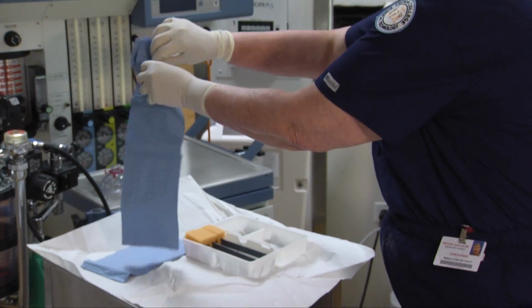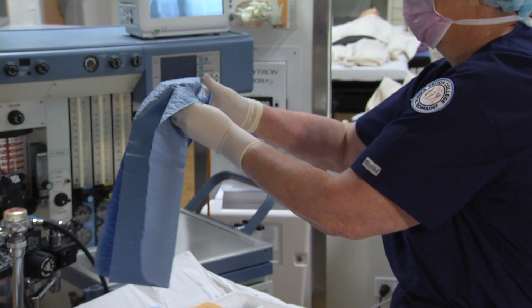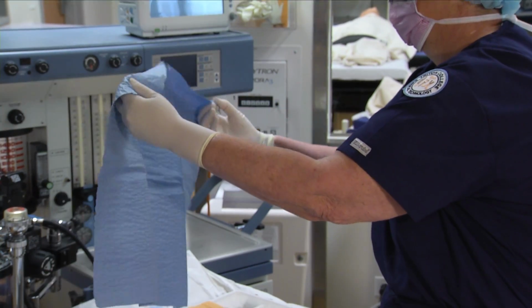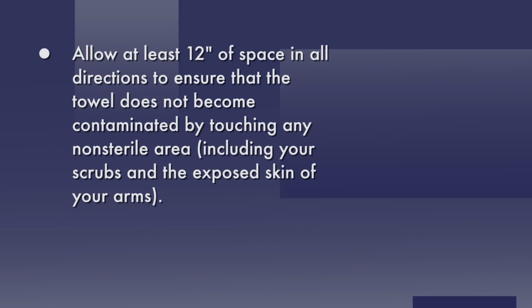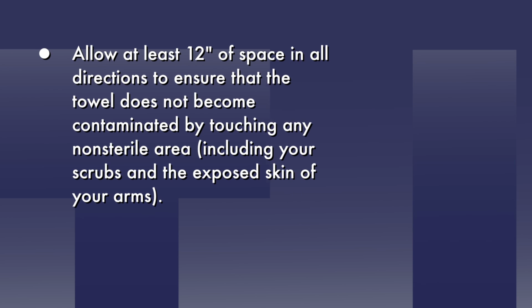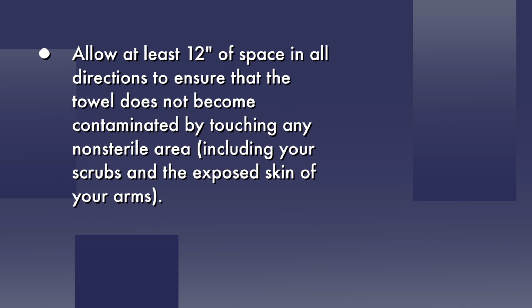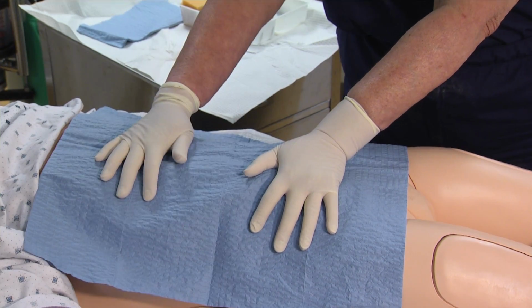Lift the first absorbent towel from the prep set and open it. Grasp the corners of the towel with your thumbs away from you, and roll the towel over your gloved hands to protect them as you lay the towel on the patient's torso. Allow at least 12 inches of space in all directions to ensure that the towel does not become contaminated by touching any non-sterile area, including your scrubs and the exposed skin of your arms. The prepped area is dried using a patting motion.